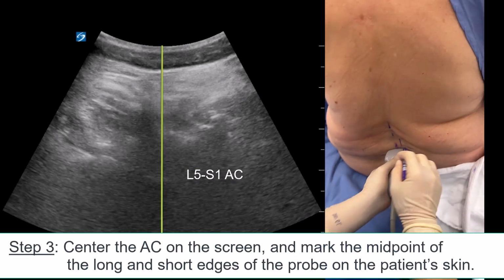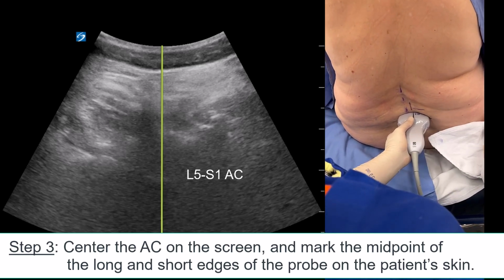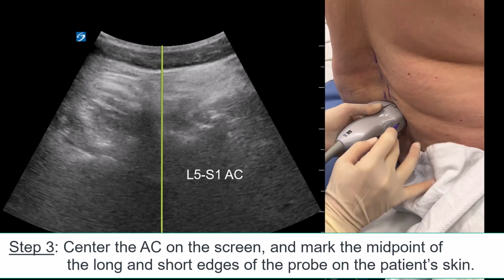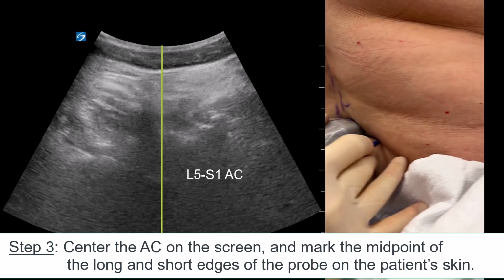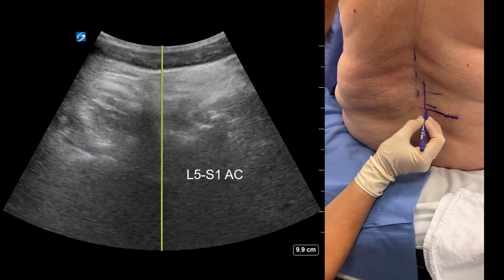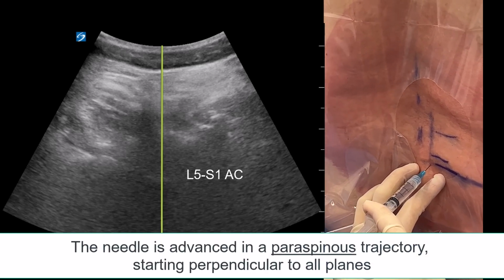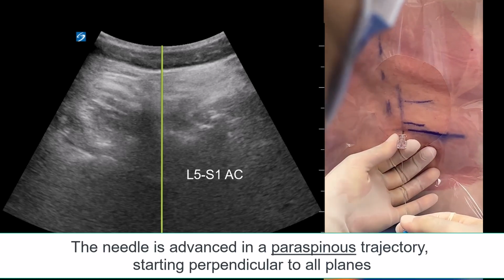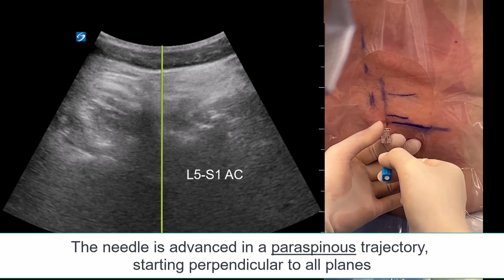Center this on the screen using the M-mode center line as a guide, and mark the position of this on the patient's skin as shown. If your skin markings are accurate, a needle inserted at right angles to all planes should enter the canal without difficulty. However, you should anticipate some inherent inaccuracy in skin marking, especially if the patient has very mobile skin.